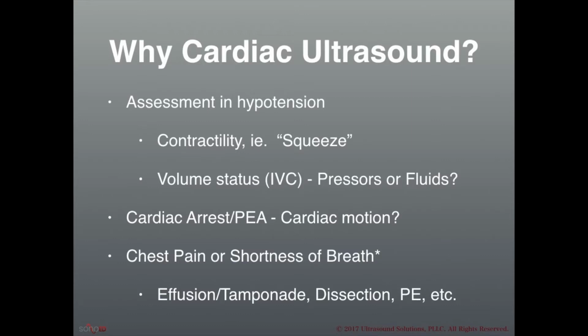So again, think of the heart as you would any other pump, and the first thing you want to know when you look at the heart is how good is it squeezing? We're going to refer to that as contractility. Is the contractility of the heart normal, or is it depressed, which we would term hypokinetic, or perhaps it's increased, maybe it's hyperdynamic or hyperkinetic? We'll refer to that as the squeeze.